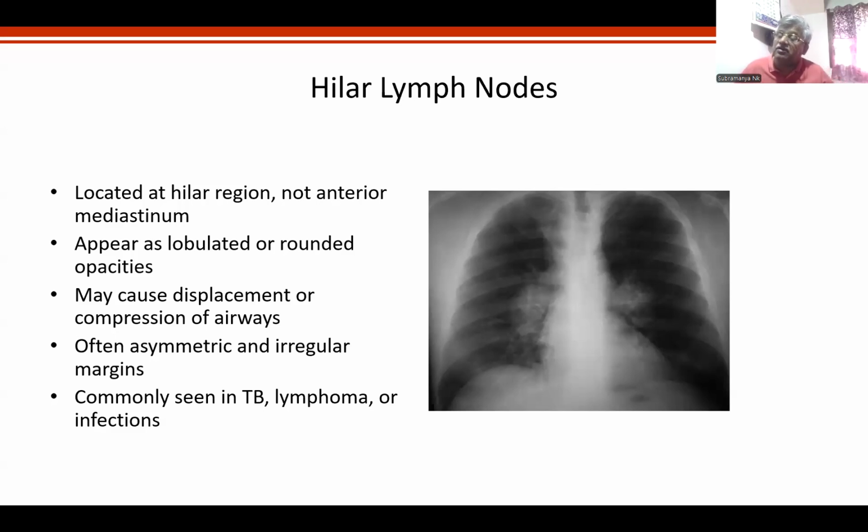If you have a doubt, you have to take biopsy or you have to take CT scan, because X-ray has a limitation here to differentiate between TB and non-TB. Very, very difficult. But you should not get confused about mediastinal adenopathy. You can make a diagnosis.